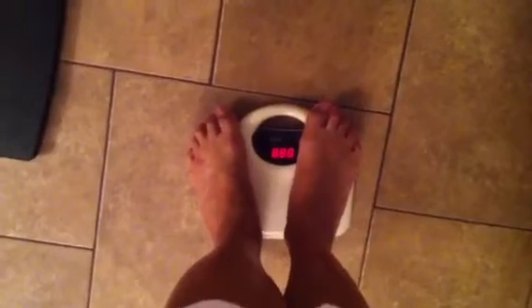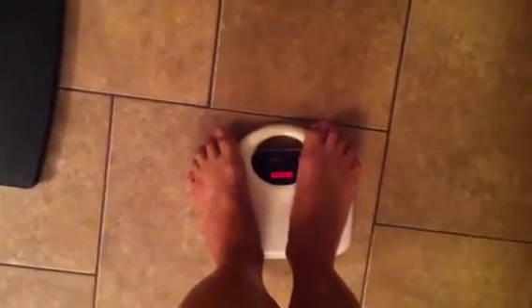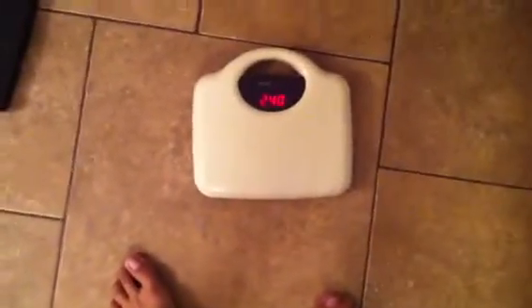Look how thin it is. Very thin. It's beautiful. Let's check out the old one. The old one was never very accurate — 240. It's a couple pounds off.